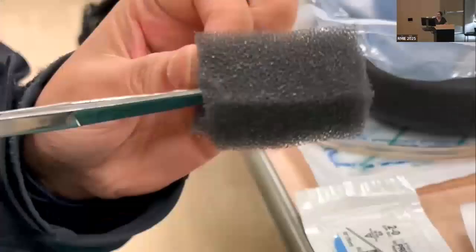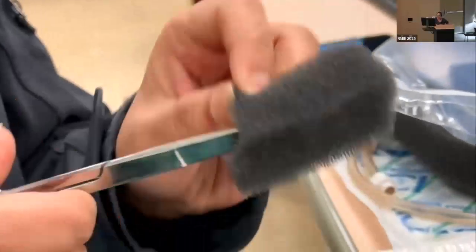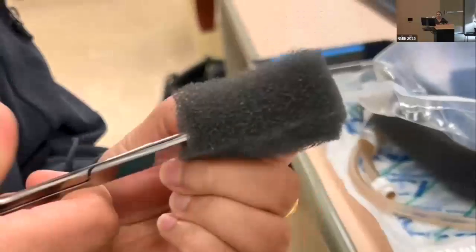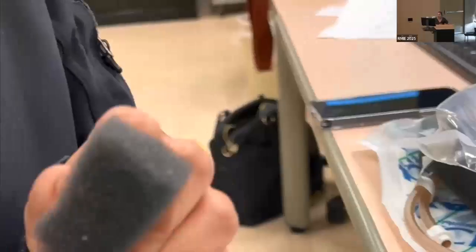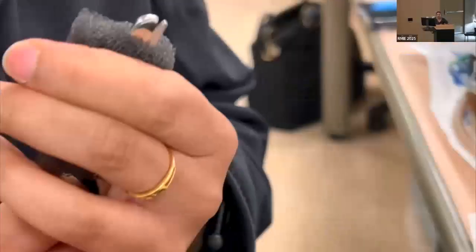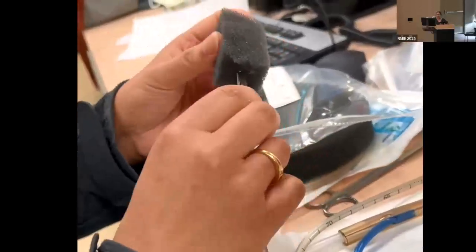All right, so how do we create or attach the sponge? It's quite an easy process. You want to cut your sponge to be sized according to your defect. I usually cut my sponges about 2 to 4 centimeters longer than the defect size, so that I have 1 to 2 centimeters of leeway above and below the defect.